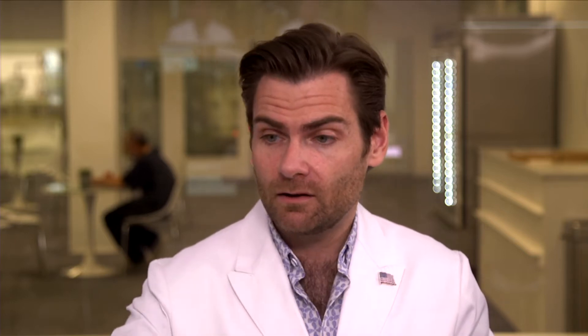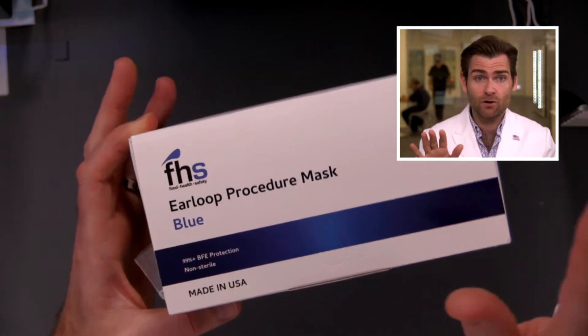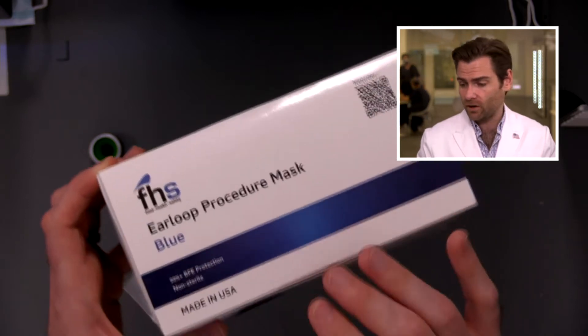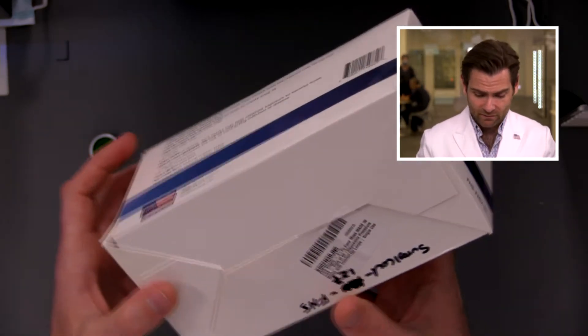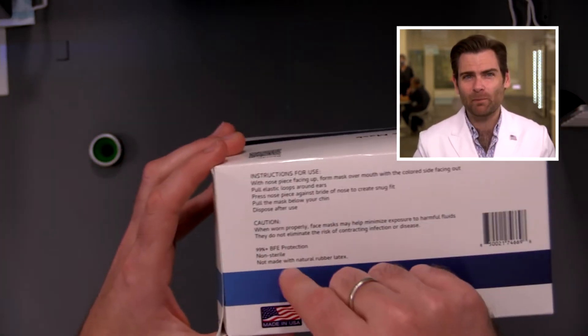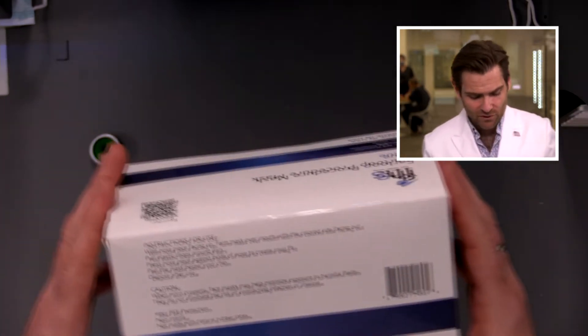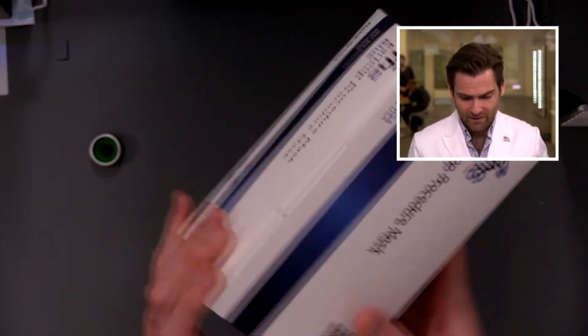Why food? This is an ear loop procedure mask, blue. You see any things on the listing there? They are making a 99% plus claim on the box here, but it's BFE. BFE, just so you know, is a totally useless stat for the coronavirus. Bacteria is way too big. So it could be BFE — I'm going to call them out on that if they're not hitting a really high number here, because people don't understand that. You're kind of marketing to them and that's not cool.